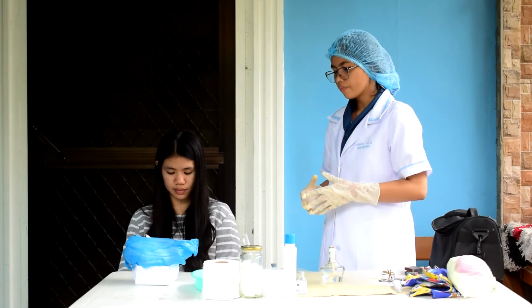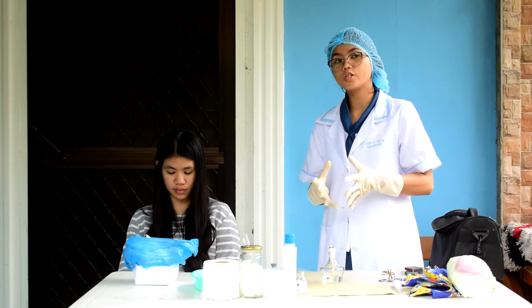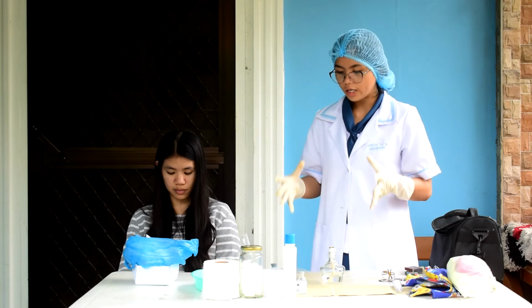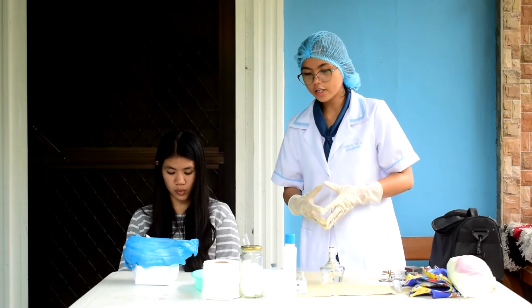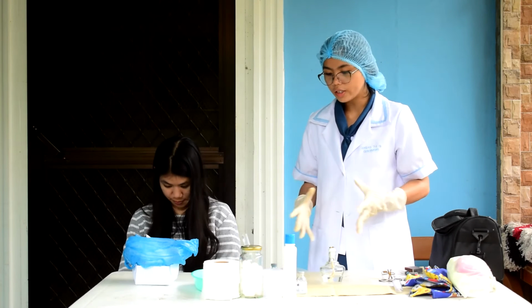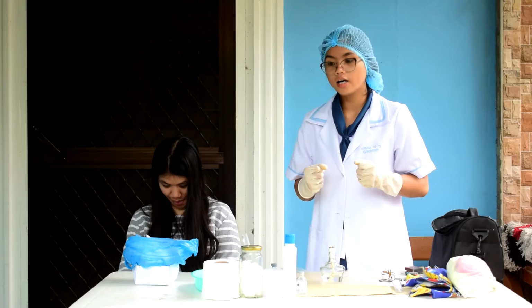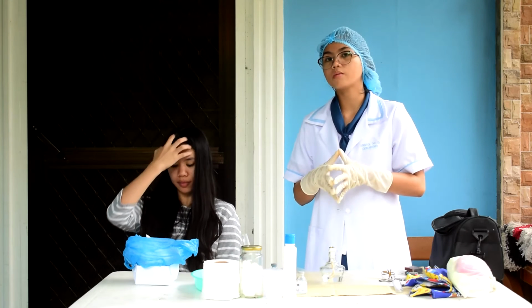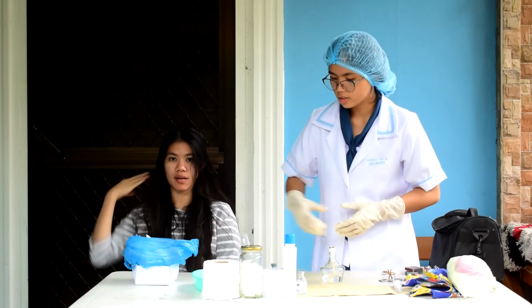So, you go with your first procedure. What do you do? In your first procedure, you fill the test tube 3/4 with urine, gently heat the upper portion to boil, and boil approximately 1 to 2 minutes.